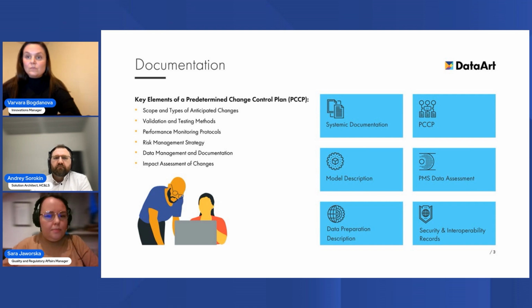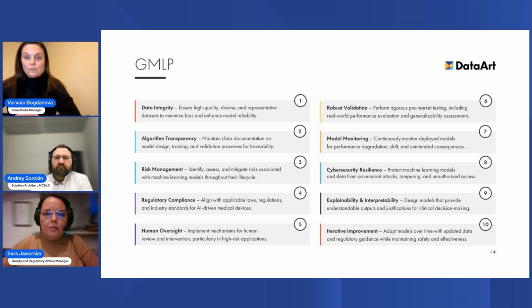When thinking about the system, of course, we still need to comply with the regular quality requirements, like the requirements of ISO 13485, the QMSR, risk management, etc. Additionally, we need to make sure there are proper security measures in place. And on top of that, good machine learning practices should be implemented and followed. They can be either implemented as part of the internal QMS or required from the vendor, depending on the business setup. And slowly we're heading to the GMLP.